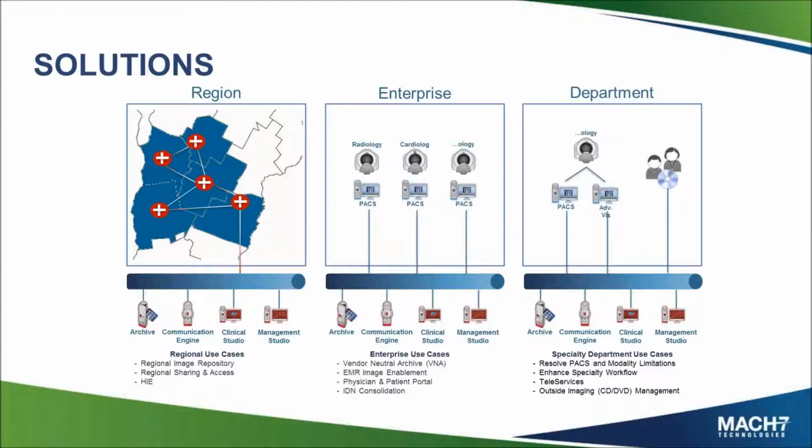If there are specialty workflows you need to do for advanced visualization, you need to split thicks and thins, you need to split chest, abdomen, pelvis, you need to get rid of special characters coming on series descriptions, so hanging protocols working in your PACS, those types of things should be able to be resolved by your enterprise imaging platform.